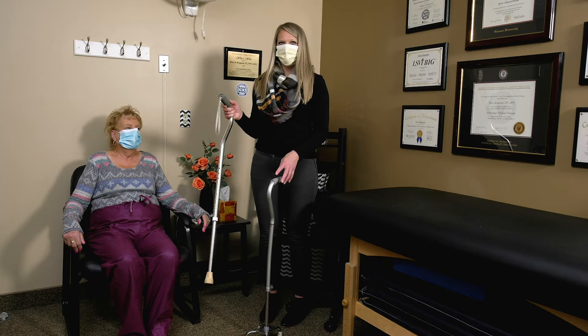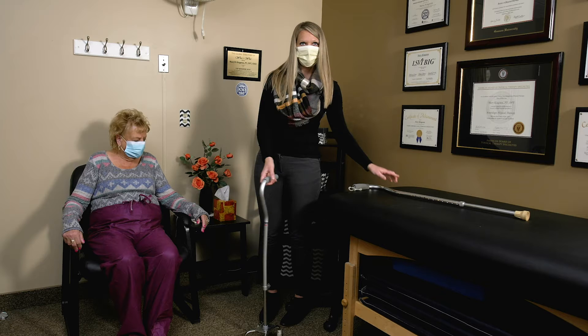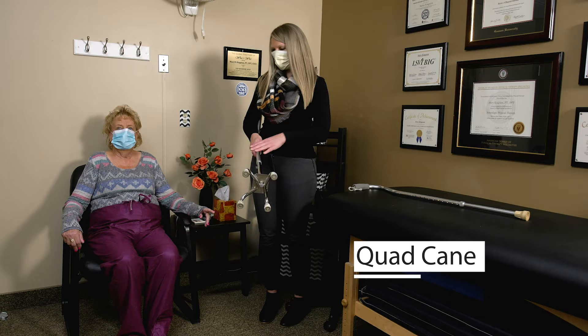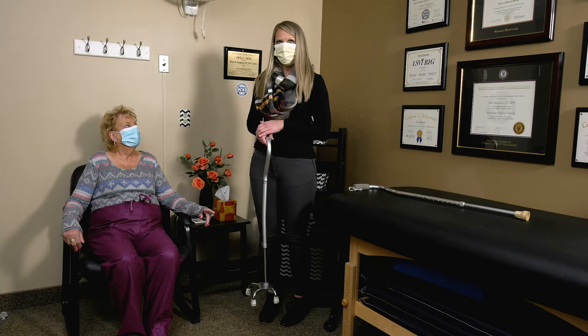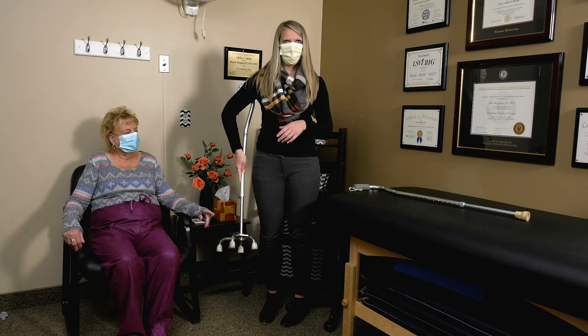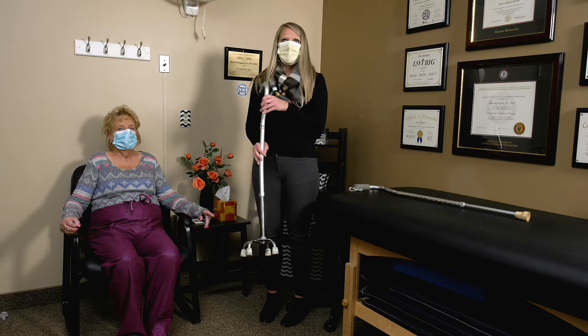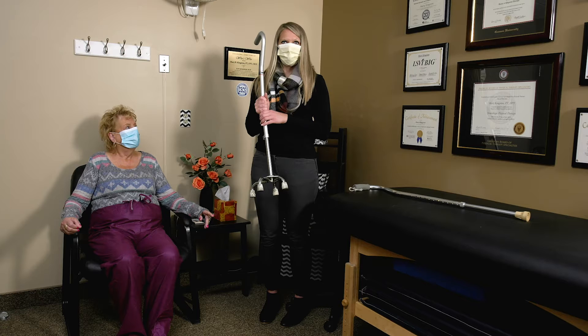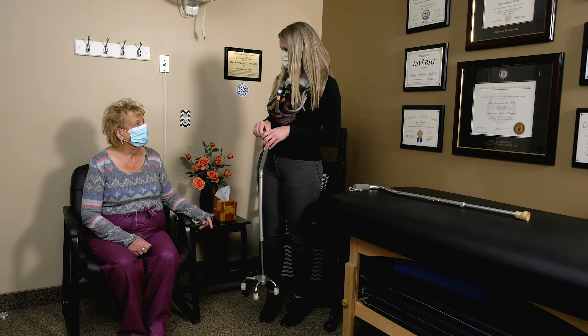This type of cane is a regular standard cane — it just has a single point on the bottom. The other type we're going to talk about is a quad cane. This is a small-based quad cane; they also make a large-based quad cane which looks the same but has a wider base. When using a quad cane, make sure it's the appropriate size, and look at the bottom to make sure the flat side of the legs is up against your body. This cane is set up for someone's right hand; if you use it in your left hand, flip the base so the flat side is against your body — that prevents you from tripping over the legs sticking out.